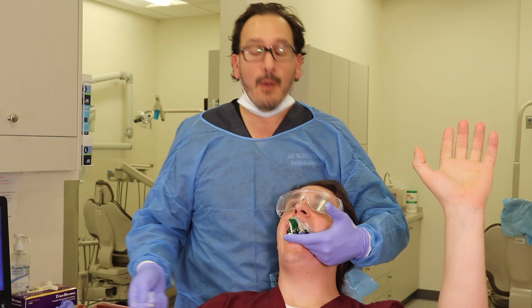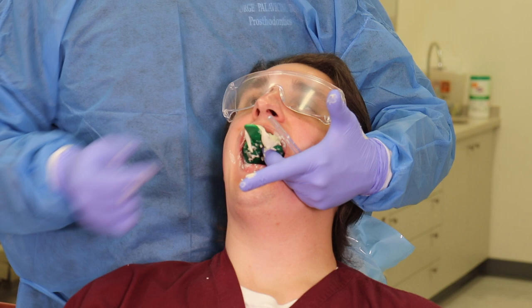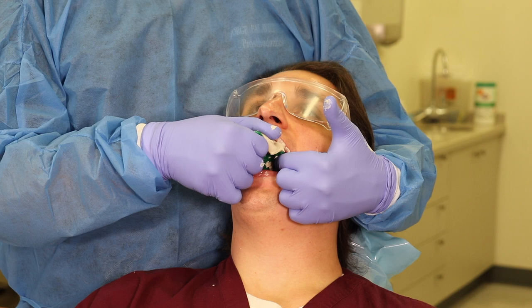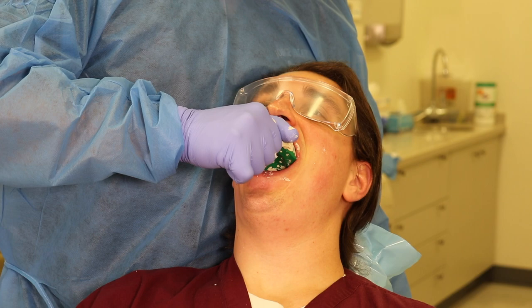When do I know the alginate is ready? I always keep a little bit outside, but also inside of the mouth. When this gets a hard consistency, it will be ready to be taken out. How do I take it out? It's very important that we use a snap motion. That means I'm not gonna be wiggling it around. I'm just gonna go in one instance from the back, and then out. You see, I broke the seal, and then I took it out.